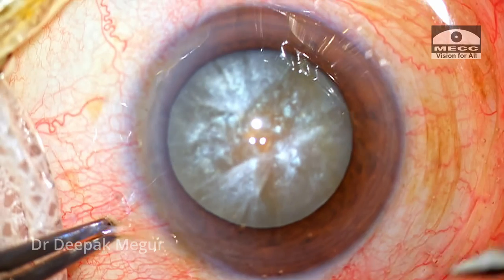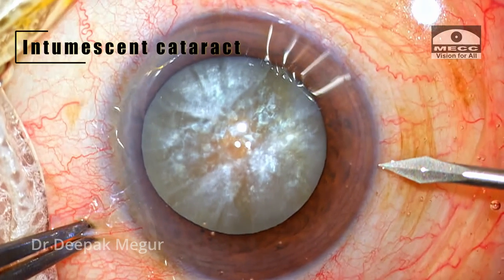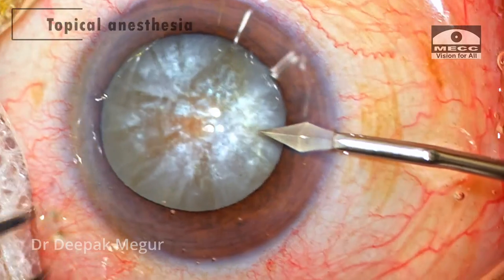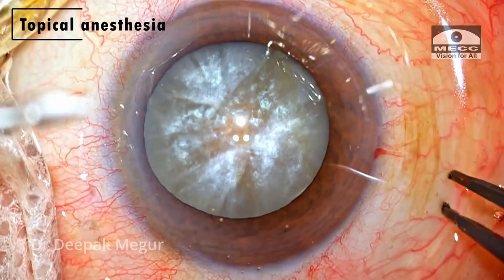Hi, I'm Dr. Deepak Meghor. Today we have a case of a 65-year-old gentleman who was having an intumescent cataract. Surgery is being done under topical anesthesia.